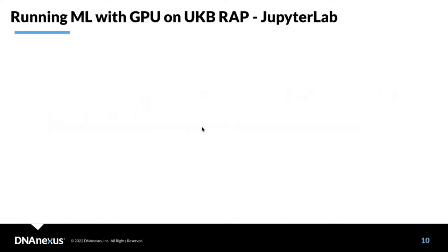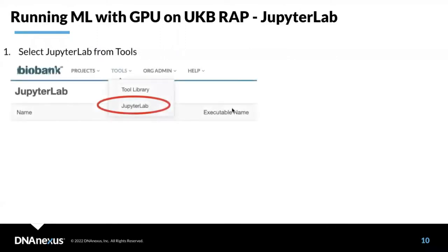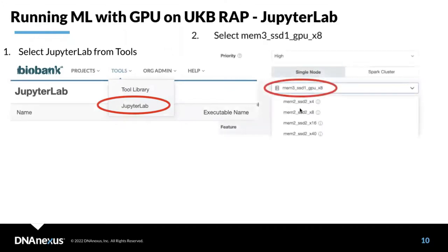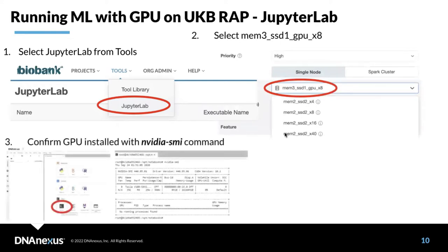To run machine learning models with GPUs on the UK BRAP, you can run a JupyterLab session. Select JupyterLab from tools, and importantly, you will need to select a GPU instance type — for example, the mem3 GPU instance type. Once your session is initialized, you can open JupyterLab and check with a specific command that all the environment is ready to go.